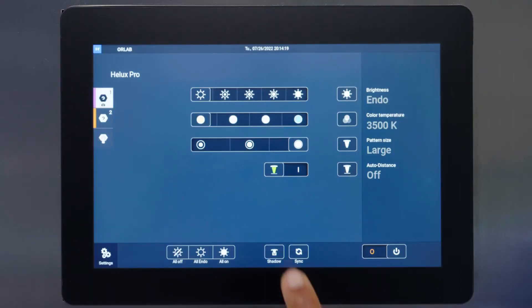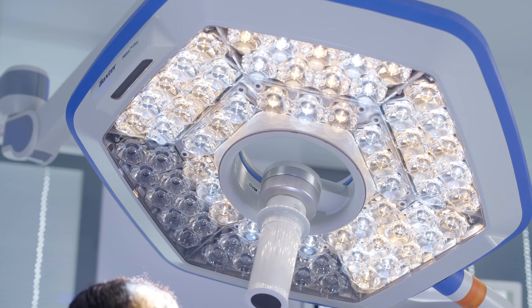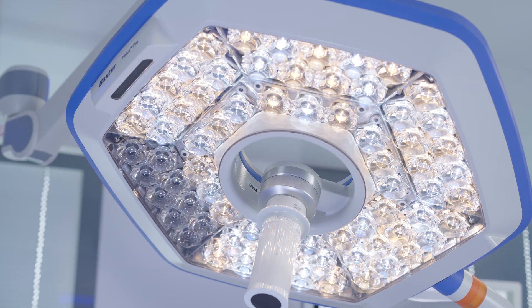Activate Auto Shadow on the wall control and the light's 3D sensor will help to eliminate unwanted shadows on the surgical field. The sensor will detect obstacles and adjust the lighting to eliminate and reduce shadows at the wound field.